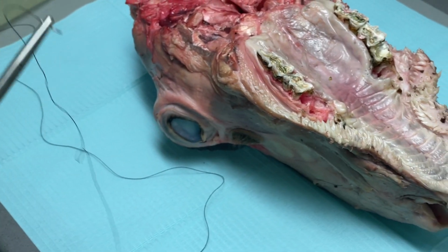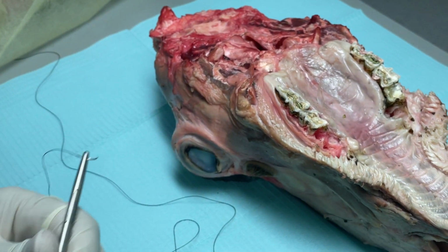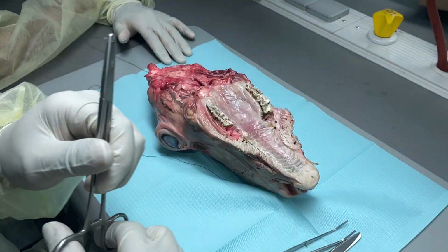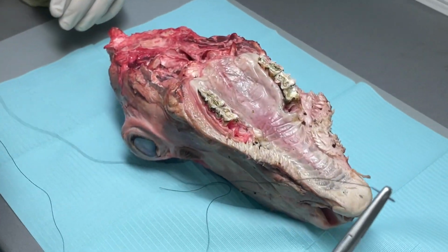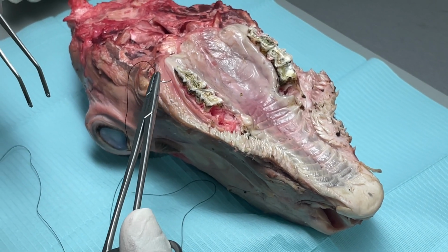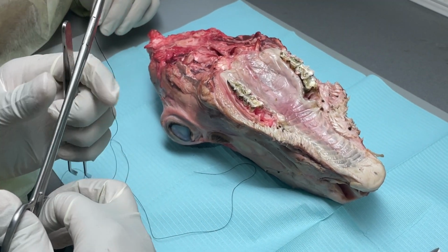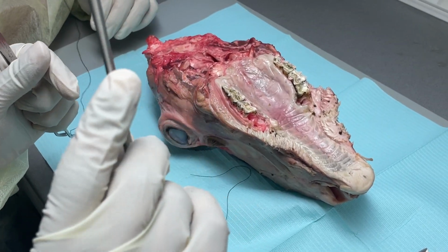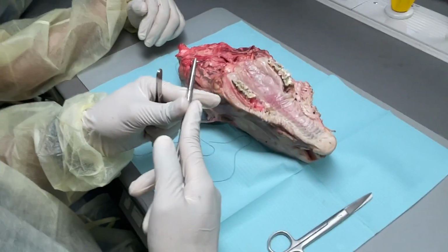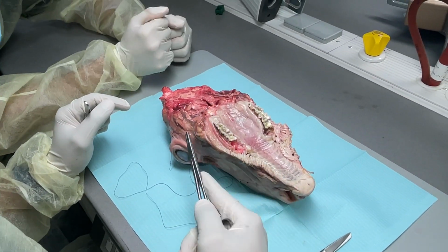This is correct. Yes? So I can pass it. Plus? Okay. Now let us see. The thing about this is, incidentally, there won't be much space to pass. That is one problem with this. You can also keep it like this, push it like this, for easily moving it.